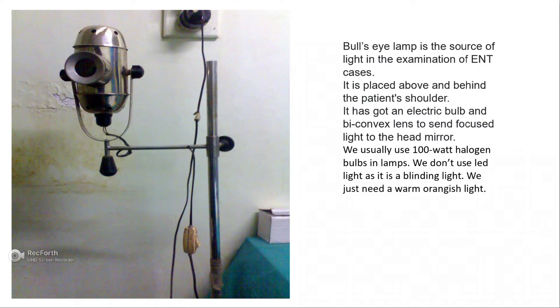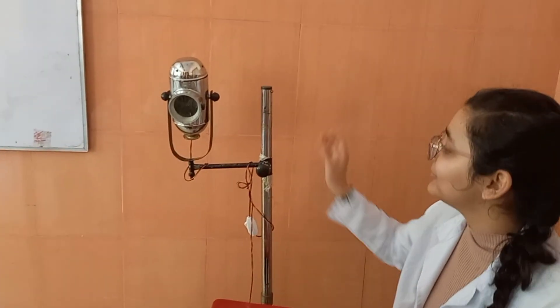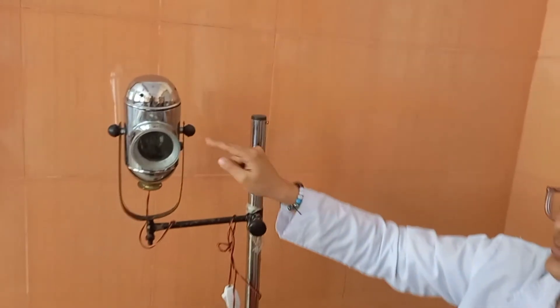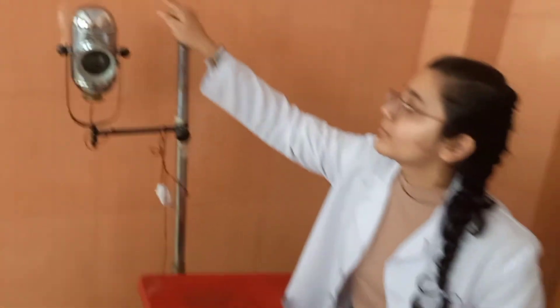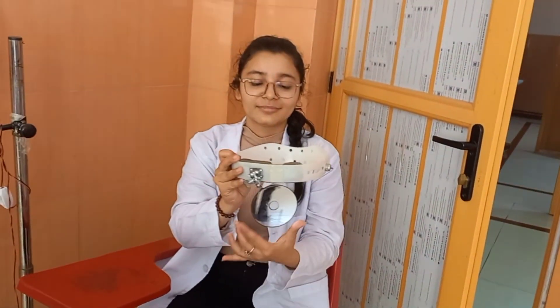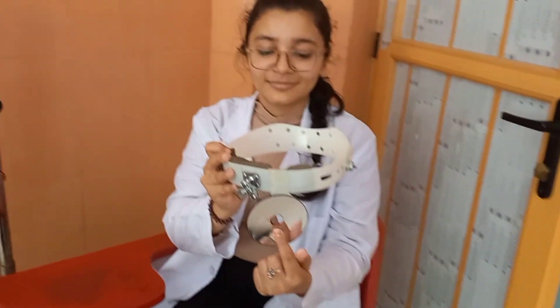That was a theoretical explanation of the instruments. Now you can watch the video where I explain how to use them. I'll be explaining only how to adjust and demonstrate in the practical. Here you can see the bull's eye lamp stand with the bulb valve and convex lens inside, and here is the headband with the concave mirror and a hole in the center, along with the hinge.